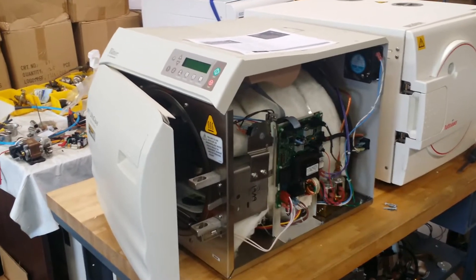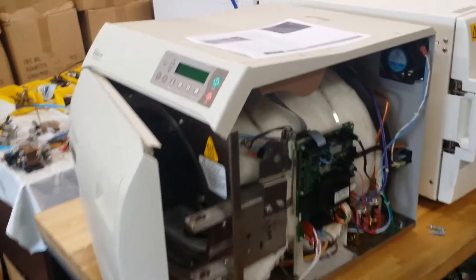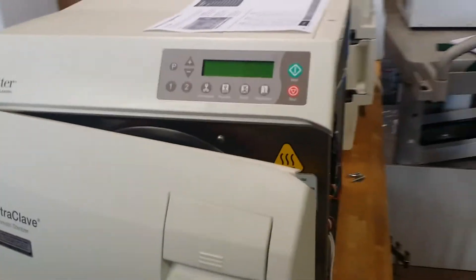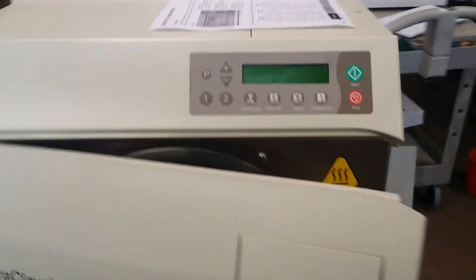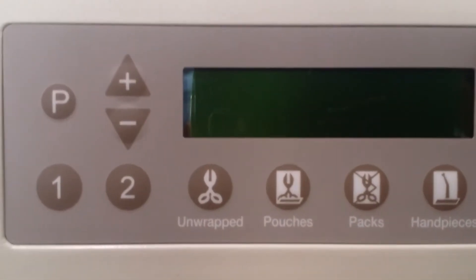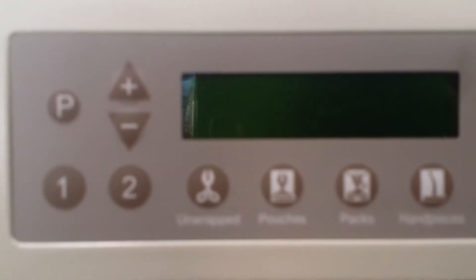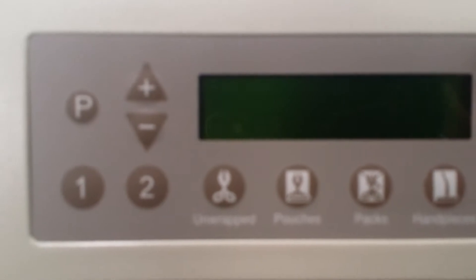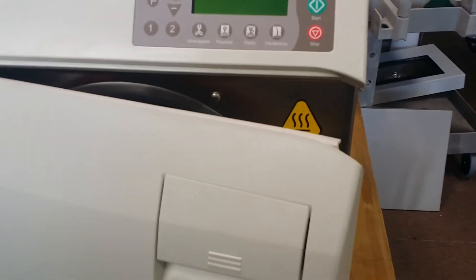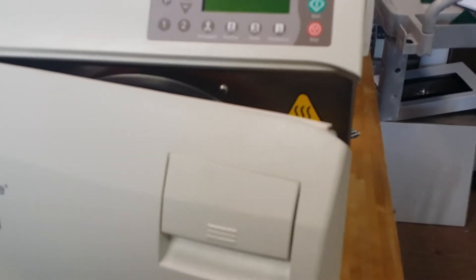Generally speaking, Midmark sterilizer is a very good autoclave in the market. It's fully automatic, so if any problem happens, you should see the error code on the display. They will give you three digits — you will see the letter C followed by three digital numbers. The first number tells you where the problem happened, which part.